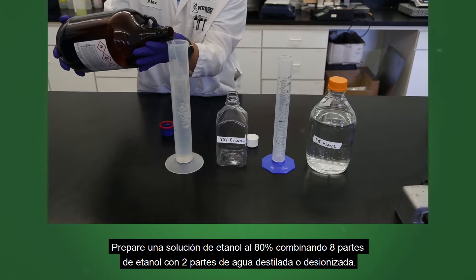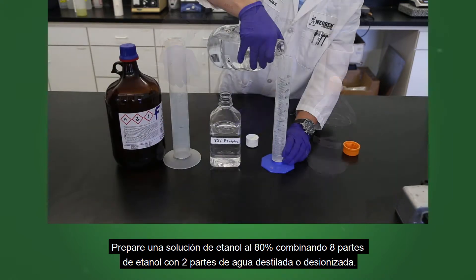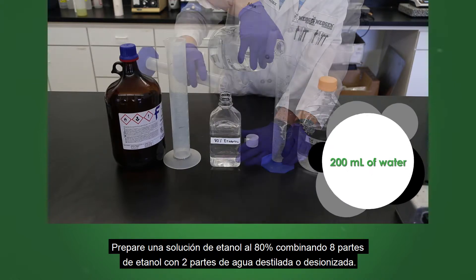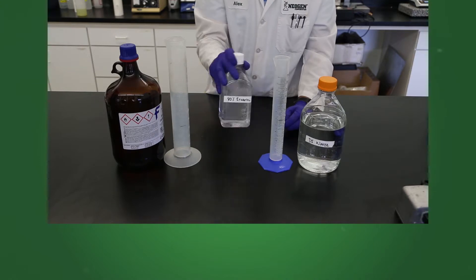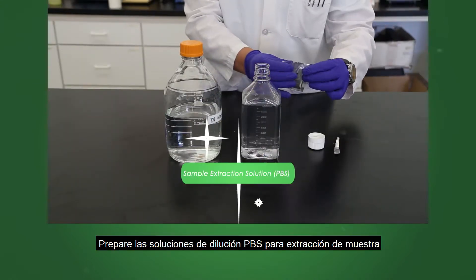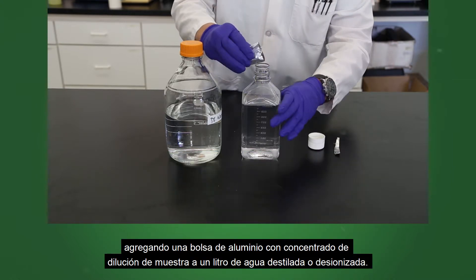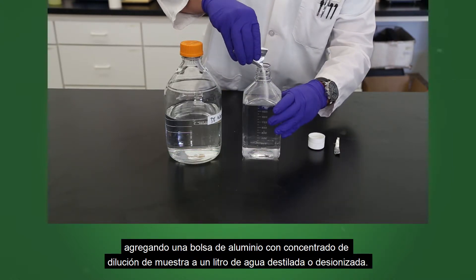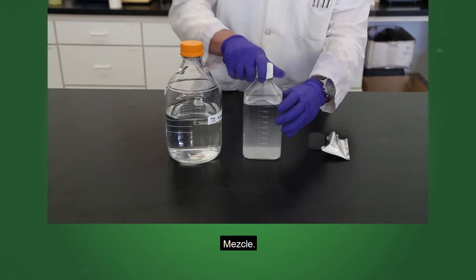Prepare an 80% ethanol solution by combining 8 parts ethanol with 2 parts distilled or deionized water. Prepare the PBS sample extract dilution solution by adding a foil pouch of sample dilution concentrate to 1 liter of distilled or deionized water. Mix.